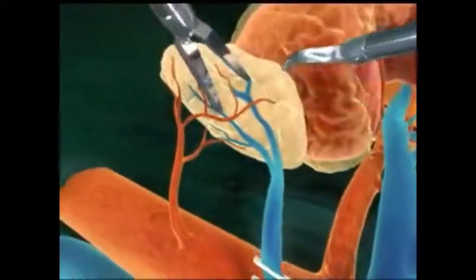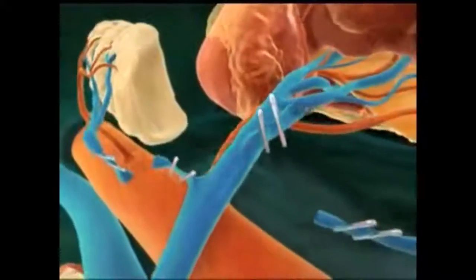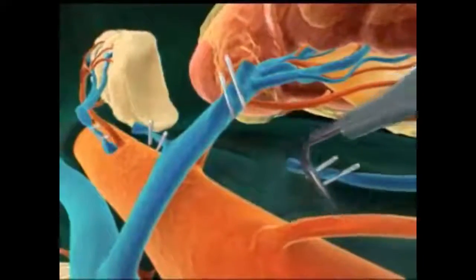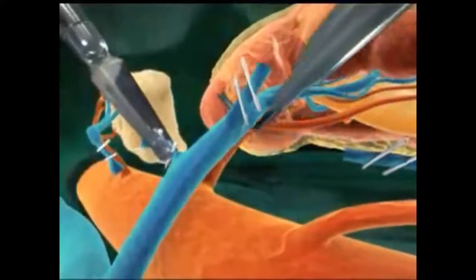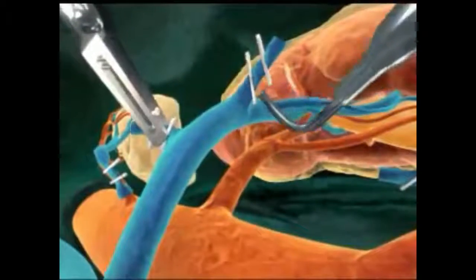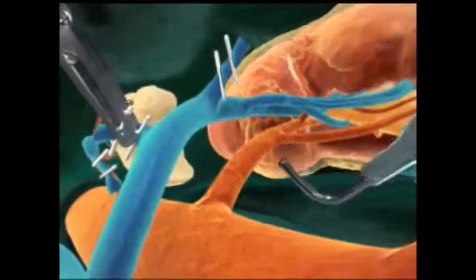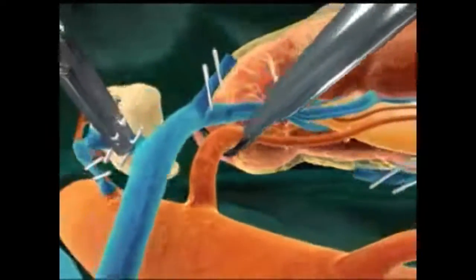Next, the adrenal gland is separated from the kidney. Then, the major renal vessels — the renal vein and then the renal artery — are dissected free from surrounding tissues.